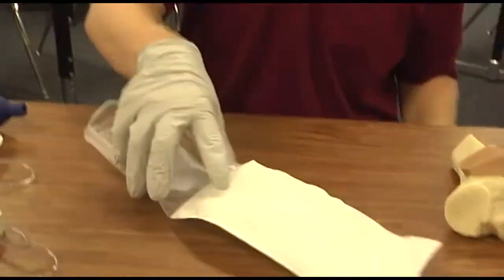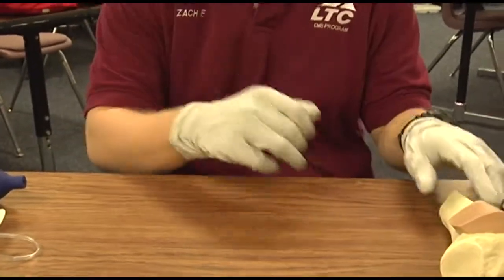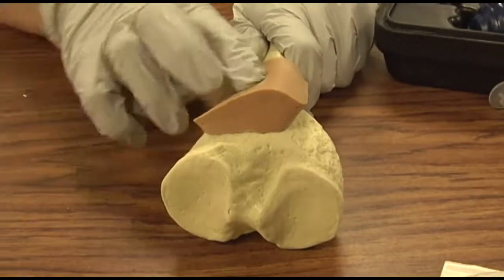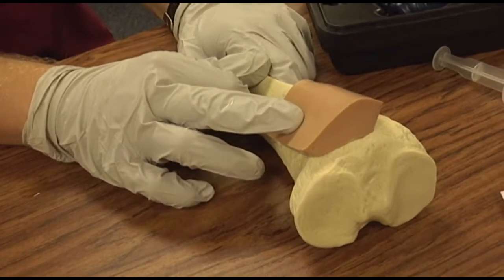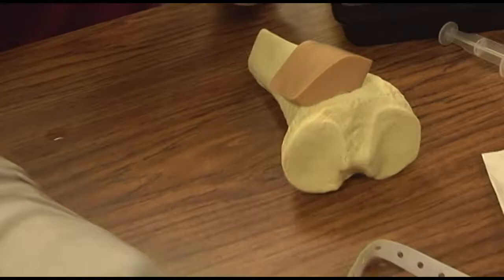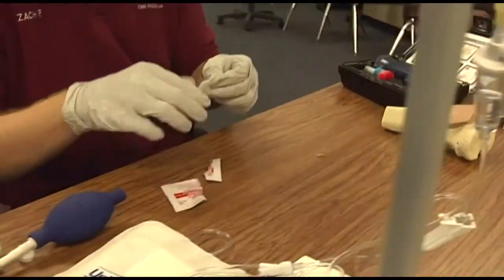You want to identify the proper anatomical site for the IO puncture: proximal tibia. Explain the contraindications: fracture, excessive tissue, infection, significant orthopedic procedure. Confirms and cleans the insertion site with alcohol.